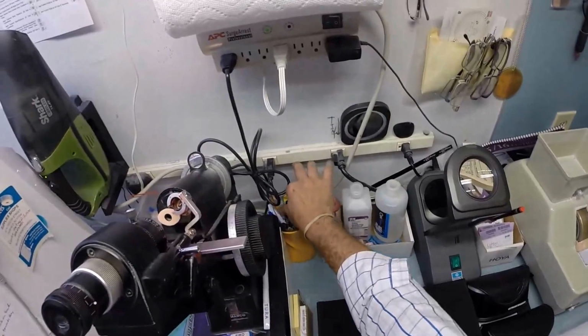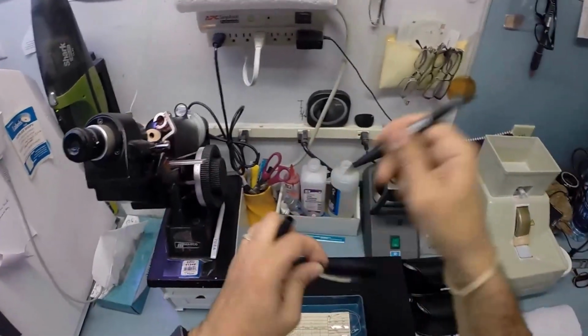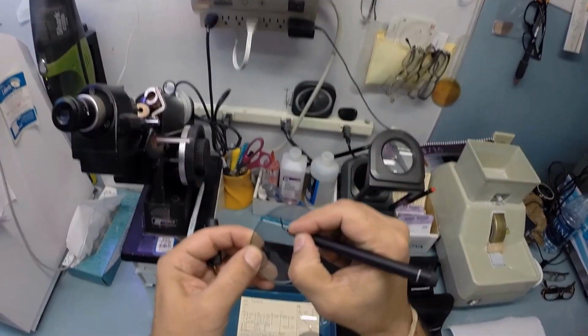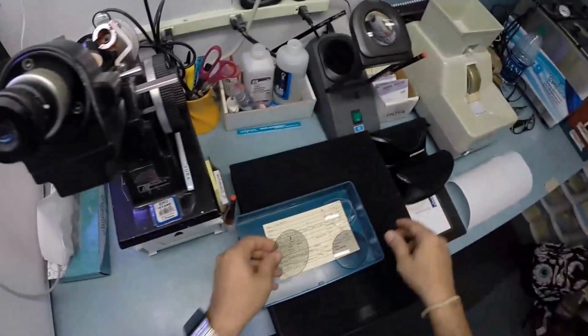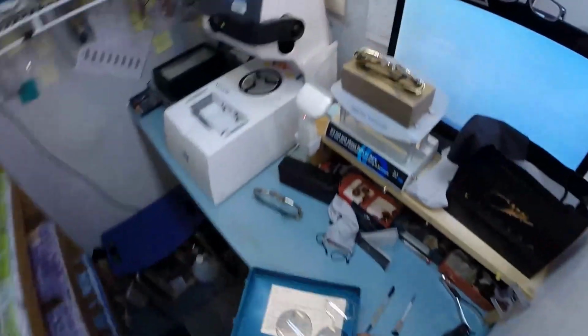And then let's go ahead and put an L on this lens, which stands for not right. And if you missed any of that, let me recap. Oh, you're not getting away with at least one bad joke tonight. But we got so much to cover tonight.